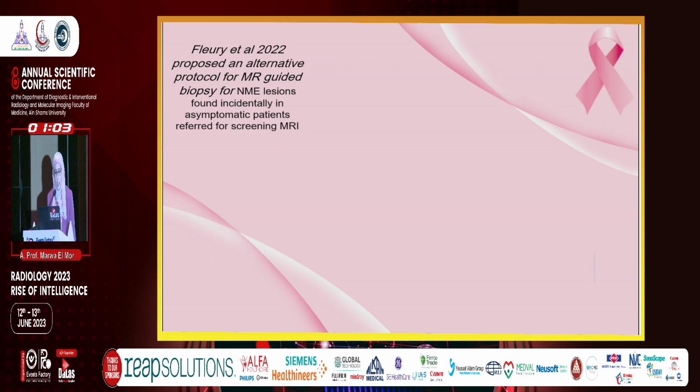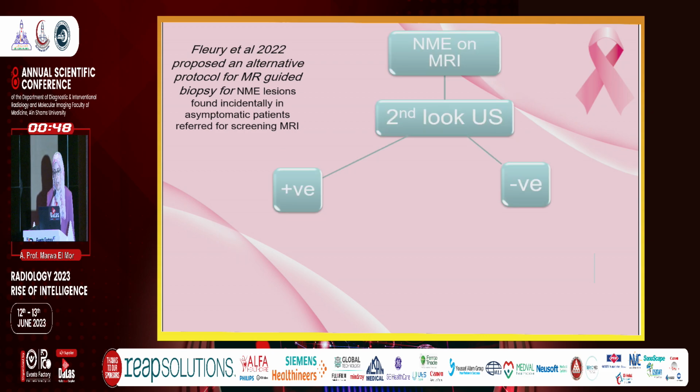Fleury et al. also in 2022 proposed an alternative protocol for MRI-guided biopsy for non-mass enhancement lesions found incidentally in asymptomatic patients referred for screening MRI. First, if we have a non-mass enhancing lesion on MRI, second, we do the second-look ultrasound. Of course, the ultrasound is the best friend for breast radiologists. So if we have a positive correlate on ultrasound, we will go for ultrasound-guided biopsy.